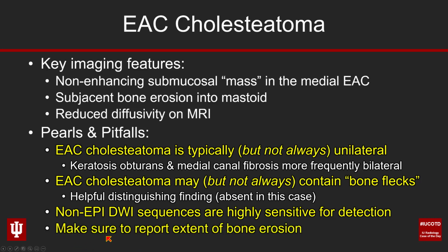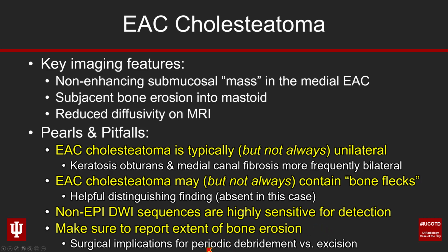One last thing to drive home this point one more time. Make sure to report the extent of bone erosion, because that may make the difference between a patient who goes for routine, periodic, in-office debridement of an EAC cholesteatoma versus someone who needs a formal surgery for a wider excision of the cholesteatoma component. So always talk about what you think the diagnosis is, but also think like a surgeon. Where's it going? What's it doing? Lay the groundwork for them. Give them a roadmap, a blueprint for their surgical management.